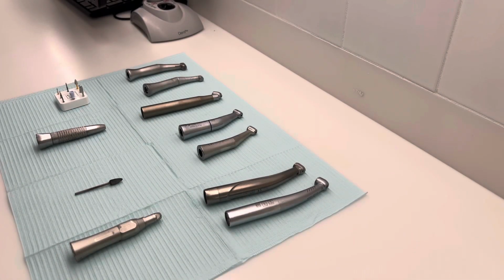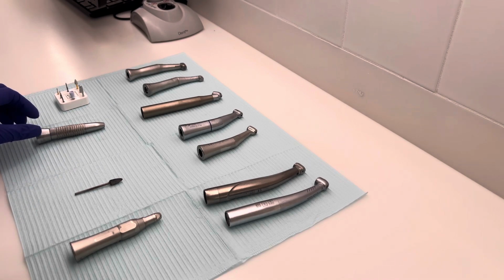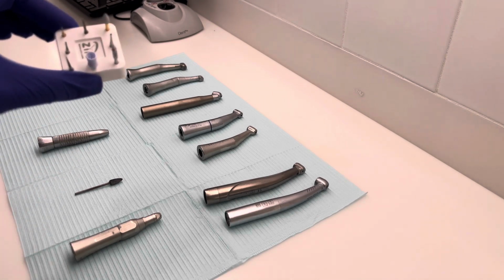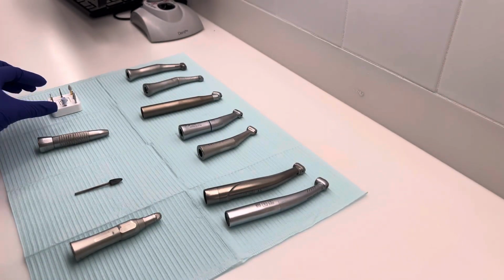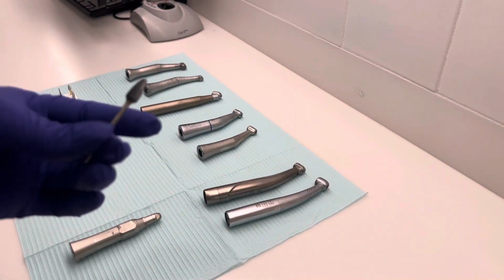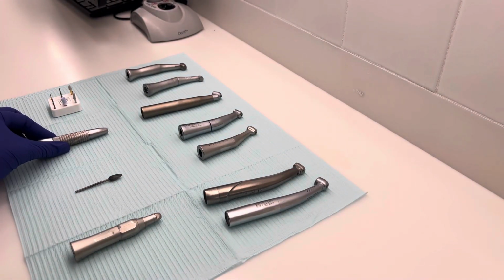Okay, without further ado, we're gonna get started. As you can see, we have some hand pieces laid out, different kinds of hand pieces, different sizes. We also have burrs on a burr block. We will be using these for demonstration purposes and to make life easy while we try to explain. You will understand as we go.